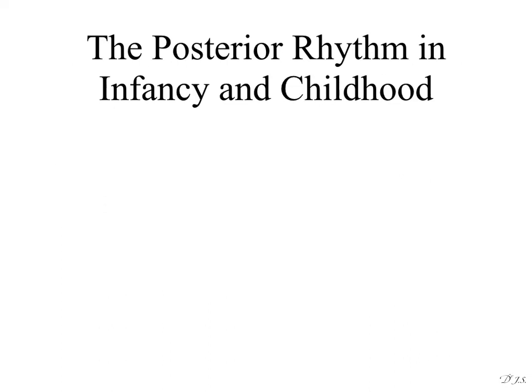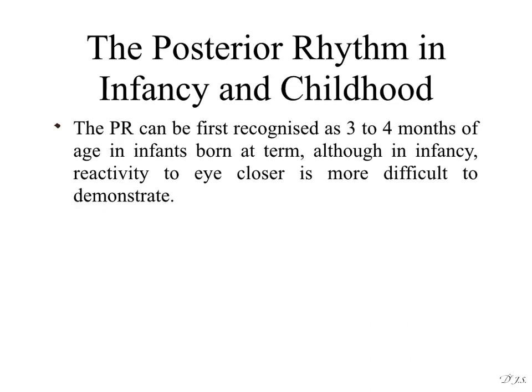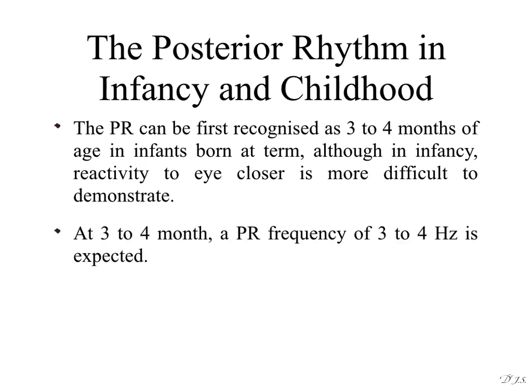The posterior rhythm in infancy and childhood. The PR can be first recognized at 3 to 4 months of age in infants born at term, although in infancy, reactivity to eye closure is more difficult to demonstrate. At 3 to 4 months, a PR frequency of 3 to 4 Hz is expected.